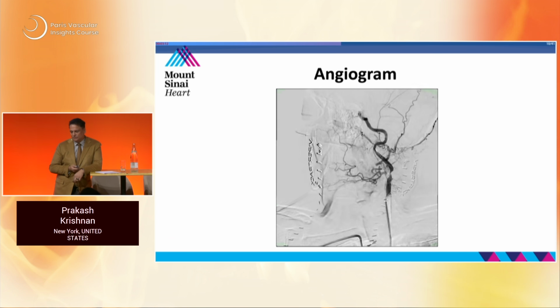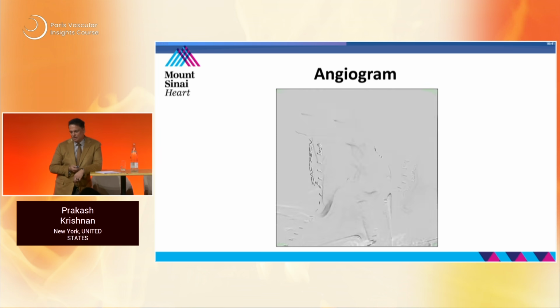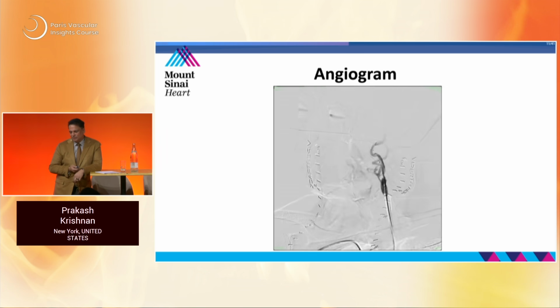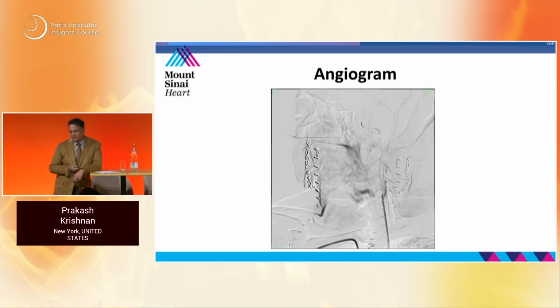And I want you all to notice at the level of the sheath what's starting to rear its ugly head even more and more. So again, stent placement was done, and we felt we could probably tackle that on the way out. And we went ahead, placed the stent, good flow, still asymptomatic at this stage. So the idea now we thought was, okay, we placed the stent, let's place an 035 wire across. Again, we work together as a surgical and interventional team. And then we'll go ahead and retrograde and then place the stent from below through the sheath.